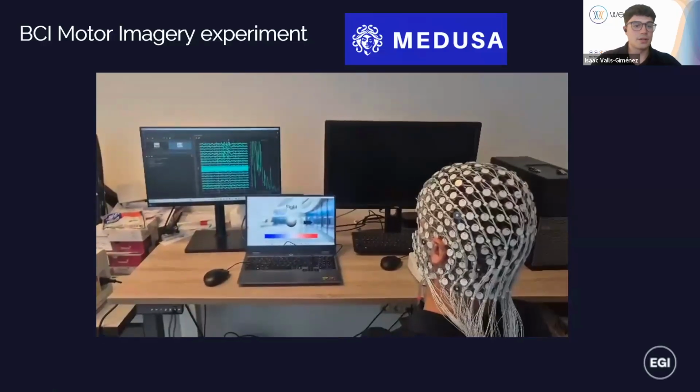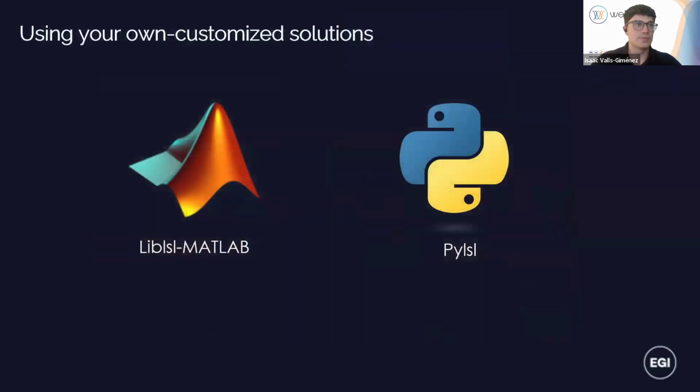Okay, moving on. Those were the ready-to-use tools that we just covered. They have already been designed, and they are made to already handle ideal buffer and chunk parameters for real-time applications, so you don't really need to play much with that. There are some configurations in NeuroPipe where you actually need to set these settings, but it's quite interactive, so you don't really have to worry about that with these interfaces. But what if you have more specific needs and you want to build your own custom setups?